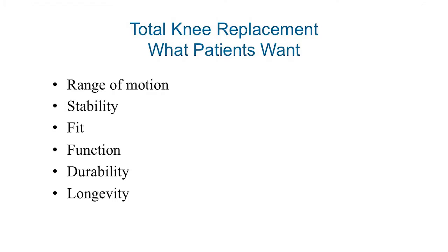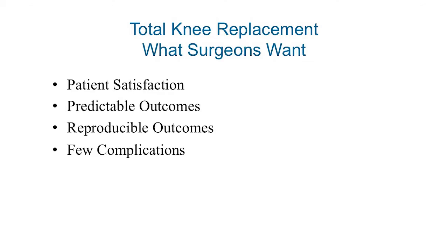And so ideally what you as patients want is improved range of motion, a stable knee, a good fit that allows you to function normally, and you want it to last a long time, so you want it to be durable. What we want is patient satisfaction, predictable outcomes that are reproducible, and minimal complications.